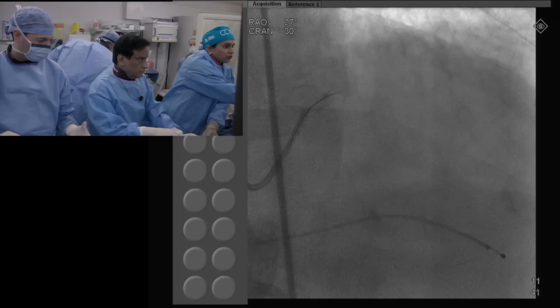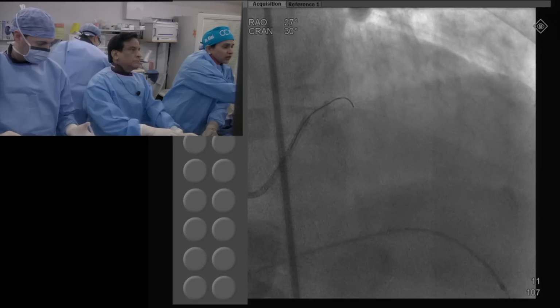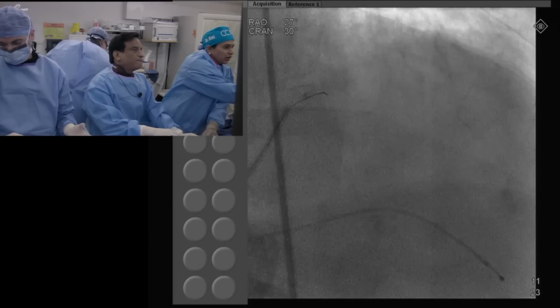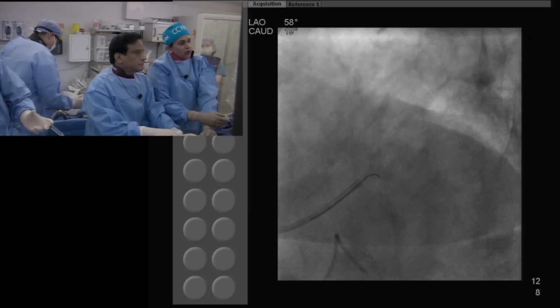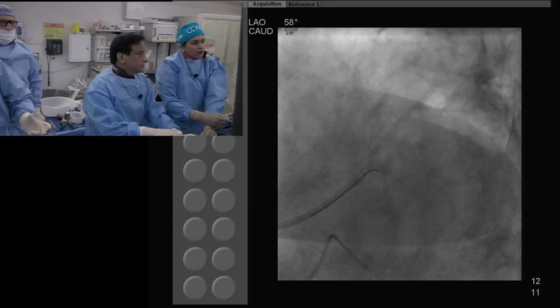So this is the picture I took, the eccentric LAD lesion, and how the wire angle is getting lost. This was just the wire, then I changed, since you need some support, so we went to a Fine Cross. With the Fine Cross, this is the picture we took, and you can see how the LAD is actually coming from the aneurysm.